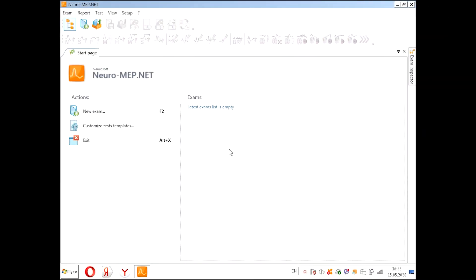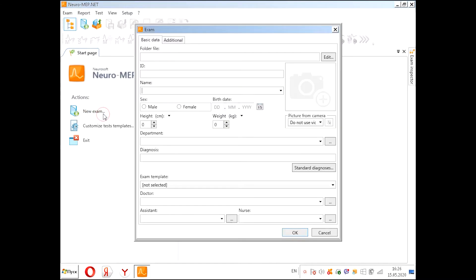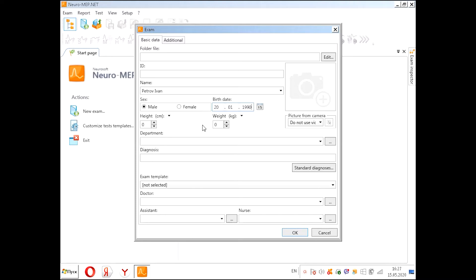We are in the main window of this program and we will create a new exam. We need to enter the patient's data and all that you need, you can enter and after that press OK.